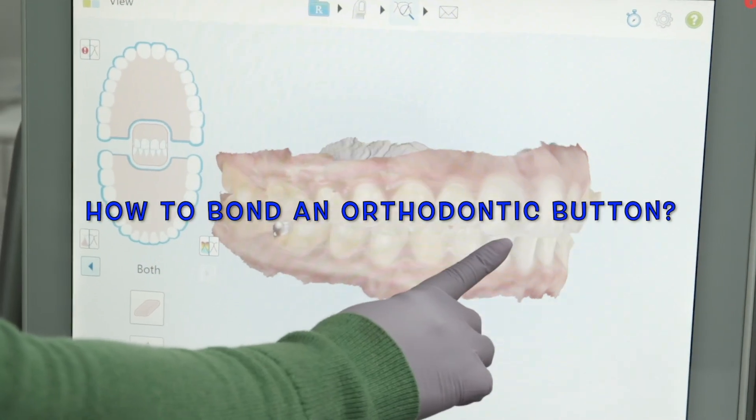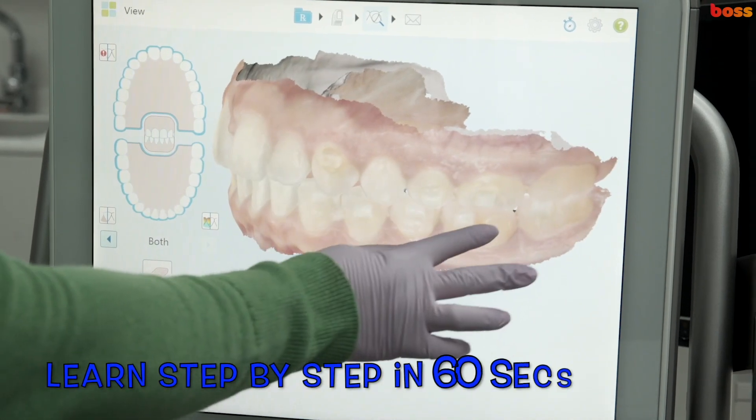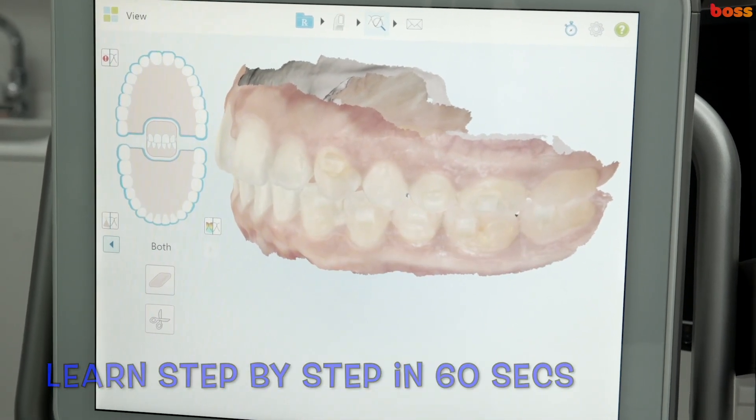Let's look at this scan today we've taken for Miss S. We've lost a button here. We will need a button because she does have to wear rubber bands just at night.